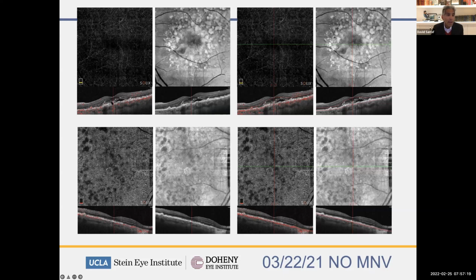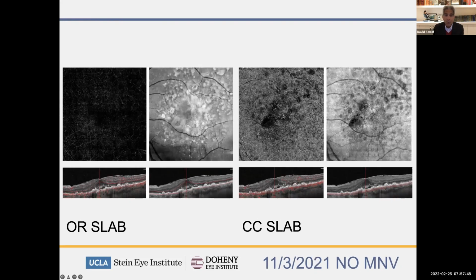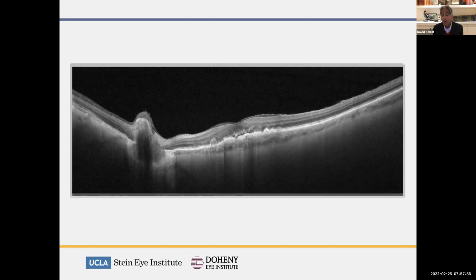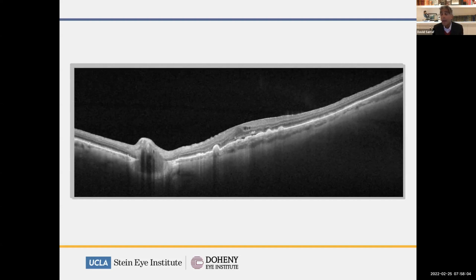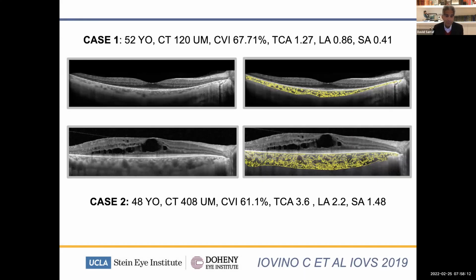Here's another example of a patient who I have to kind of embarrassingly note that I was treating for several years because she had these large areas of fluid over these large confluent drusen. But then I would look at the OCTA every month or every several months, and I didn't see any neovascularization. Again, here, several months later, we stopped the injections, still no neovascularization. And I'll show you the time-lapse video once we stopped and started the observe and extend regimen, longer and longer intervals, but the fluid doesn't change. And this is because there's no neovascularization, as we confirm with OCTA, and this fluid is just likely related to RPE pump impairment. And you can see no change. All right, so that's non-neovascular fluid in AMD.